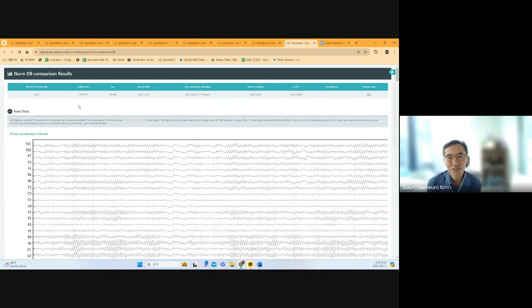So the combination of iSyncBrain, the iSyncWave scan, iSyncBrain MCI, and this kind of analysis, finding the location and then targeting that location. In this case, the global slowing, so we applied a little bit high frequency PBM. That kind of seamless scan, analysis, PBM and monitoring makes, for example, a 12 weeks intervention make the MCI people healthier. So that's our POC result last year.